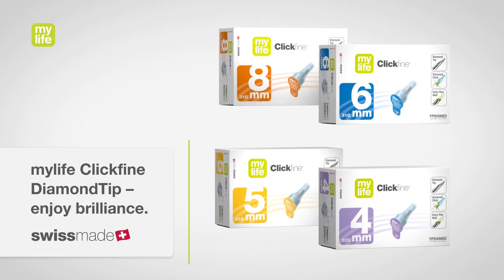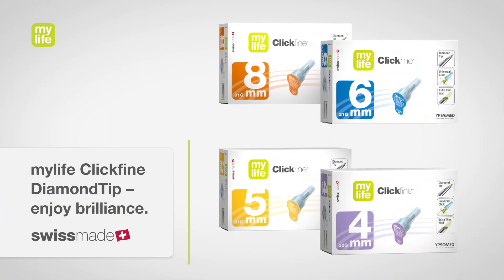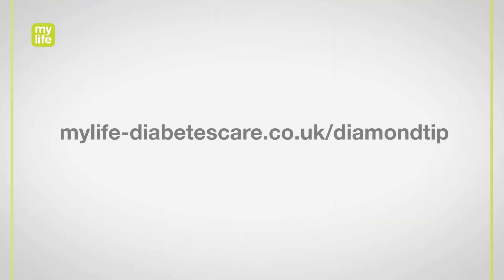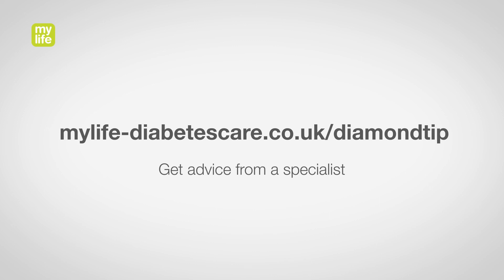The MyLife Clickfine Diamond Tip Pen Needles. Simply brilliant. Find out more at mylifediabetescare.co.uk/diamond-tip and get advice from a specialist.